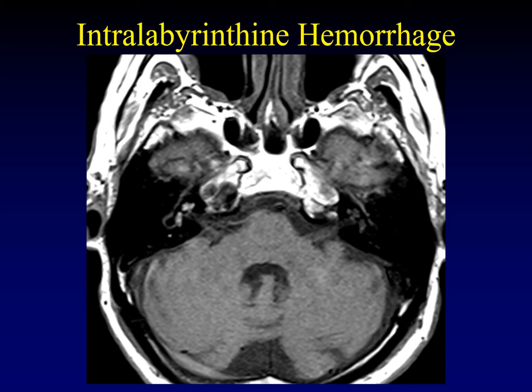Be careful of intralabyrinthine hemorrhage. When you have trauma to the cochlea and vestibule, that may not be enough trauma to cause an actual fracture of the otic capsule, but just enough to jar the membranous labyrinth — you can get hemorrhage into the labyrinth itself. At first glance, you might mistake this for enhancement because it looks just like labyrinthitis. But if you look carefully, this is a non-enhanced scan, so that's intrinsic T1 signal — intralabyrinthine hemorrhage, usually a result of trauma.